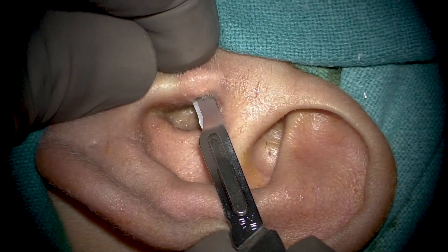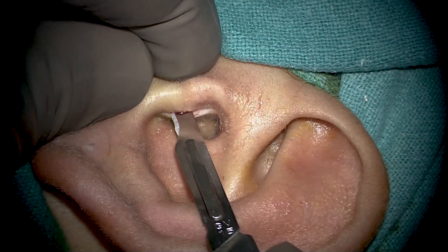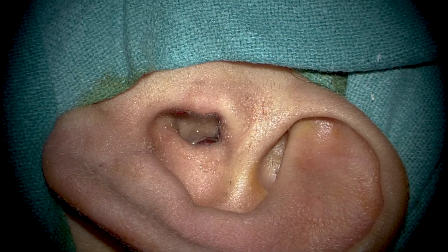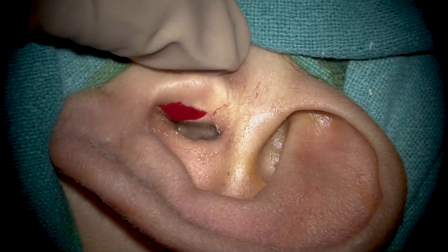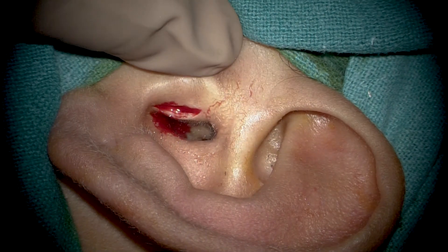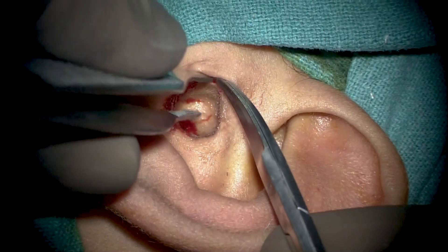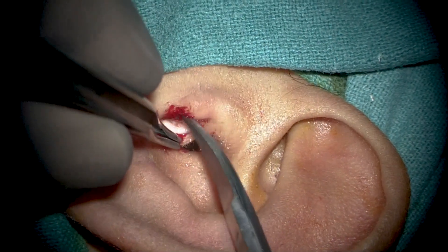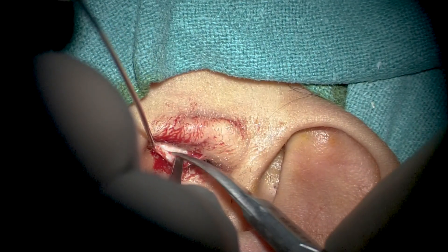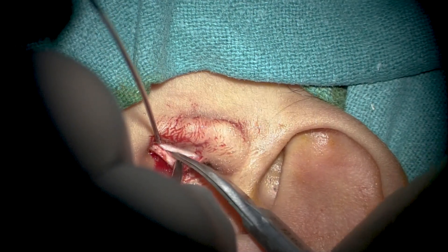We now harvest a standard small portion of tragal cartilage graft, which we will use full-thickness with the perichondrium side facing laterally towards the ear canal, and the bare side of the cartilage facing medially towards the ossicles, to avoid any adhesion between them. A single-side perichondrium left attached to the full-thickness cartilage helps maintain the overall vitality of the cartilage long-term and prevents it from becoming dysmorphic, which bare cartilage with no perichondrium can become over many years.